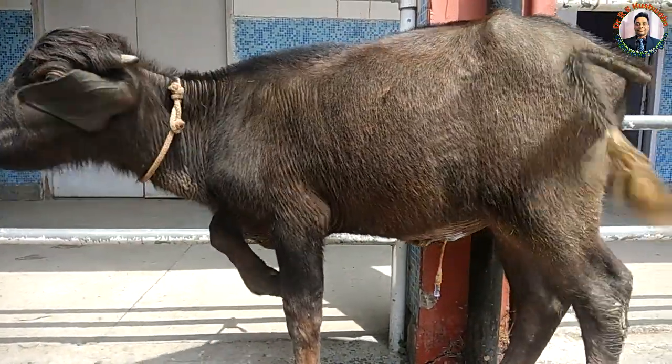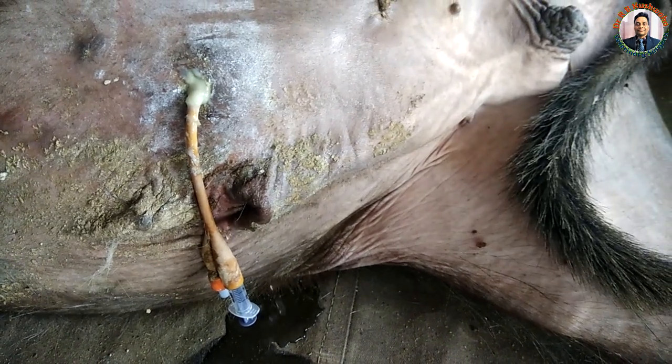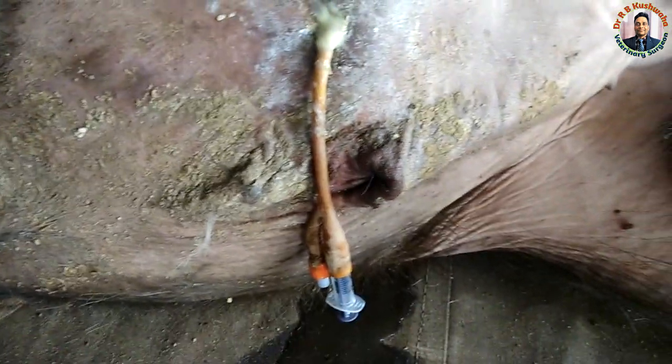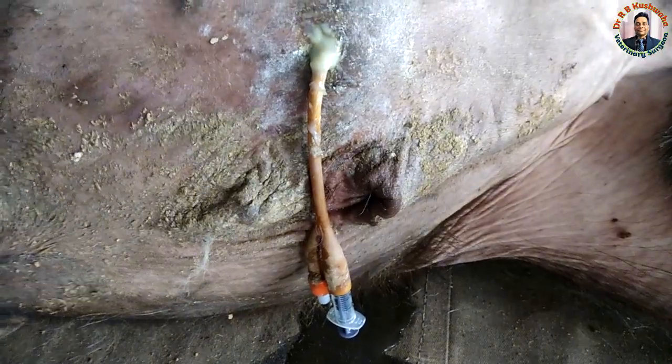For removal of the Foley catheter, we place the animal in right lateral recumbency. In this position you can appreciate how freely the urine is coming from the normal urethral opening. You can also see there is a discharge of pus from the subcutaneous tunnel site. The laparotomy incision has also healed, and we removed the stitches from the laparotomy site.